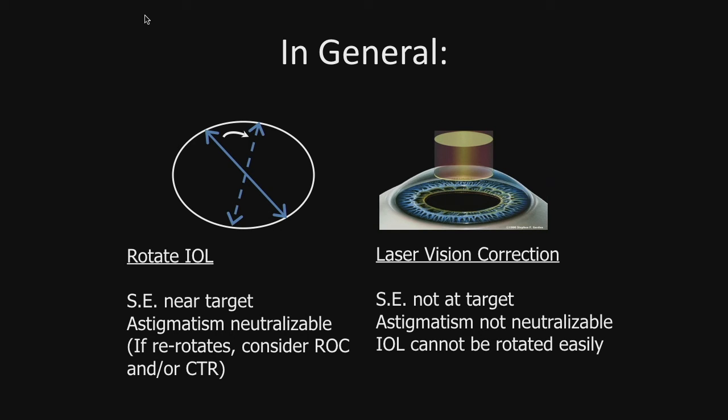And if this does not look like it's going to work, laser vision correction is an option, IOL exchange is an option if these cannot be rotated easily.